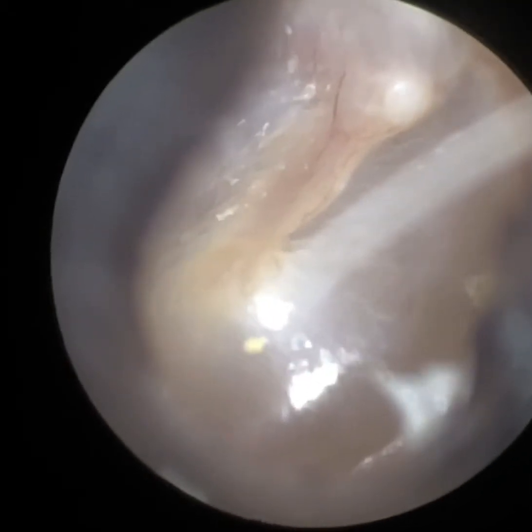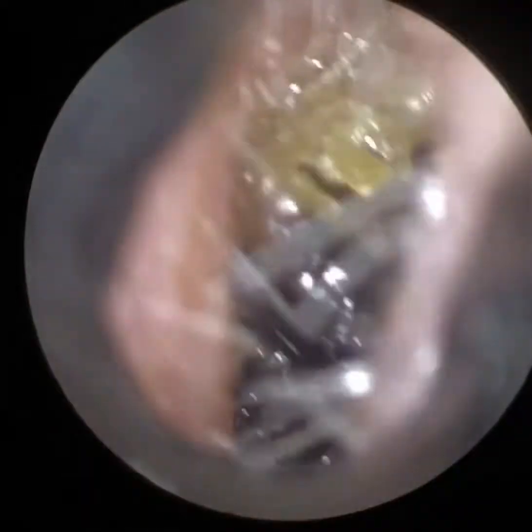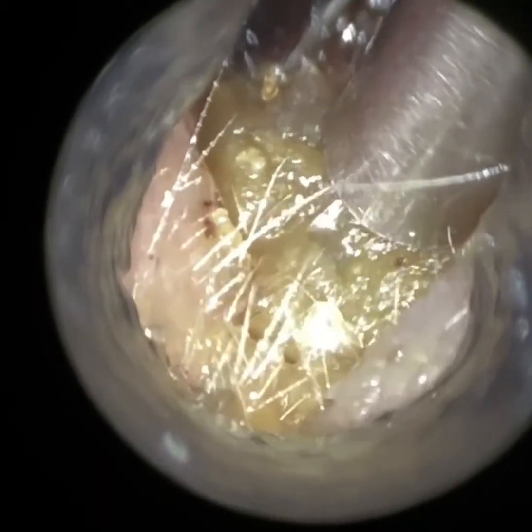That's the hammer bone — the malleus. You can even see the capillaries on the hammer bone — there's a stunning view there. This is the patient's left ear, and again this keratin had crystallized. This is probably more stone-like — it was even more hardened. You can just see that colour — that's all built up in nine months; we see this patient every nine months. This one is much more embedded. The patient felt this ear was more comfortable, but you can see this plug has expanded and is now compressing against the canal wall — so there's no opening, no widening — the patient's just got this hard, almost stone-like mass in the ear getting bigger and compressing against the canal walls, creating a complete seal.